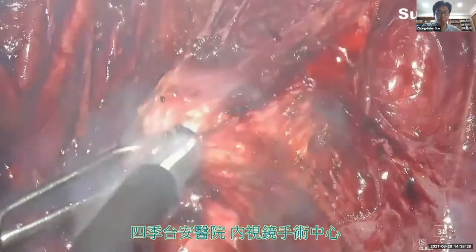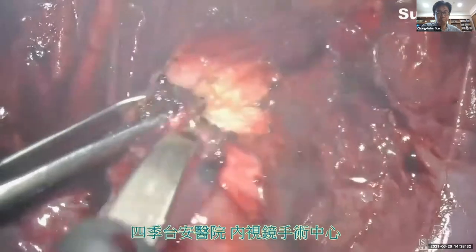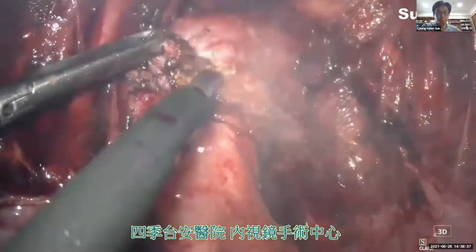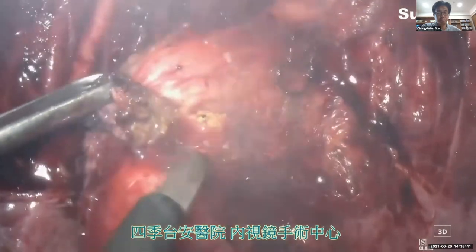Now we are still removing the perirectal fat, but if we cut too deep into the muscle layer, you will see there will be some bleeding vessels appear.